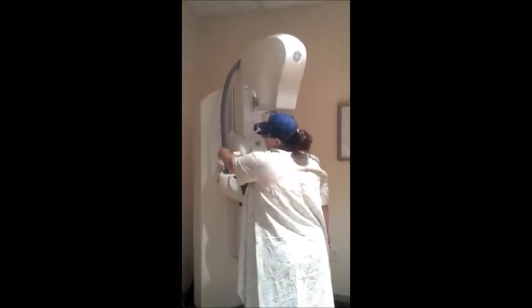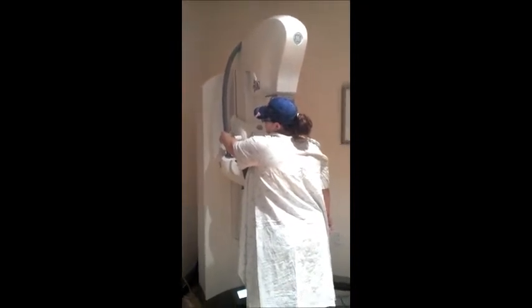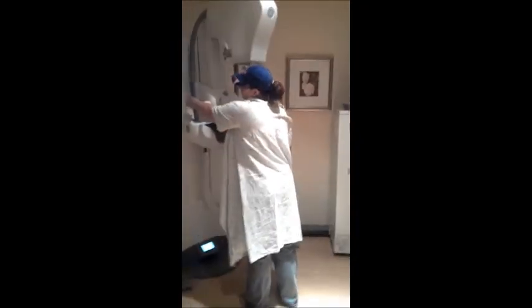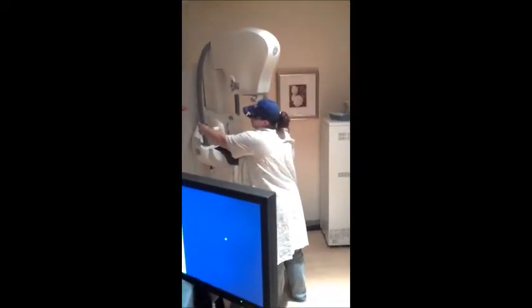Oh, you're doing great. Okay, that's it. Don't move. Let's go two steps, just right this way.